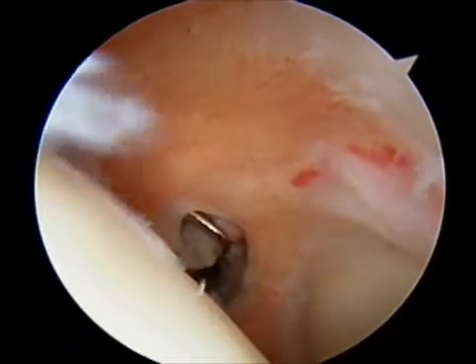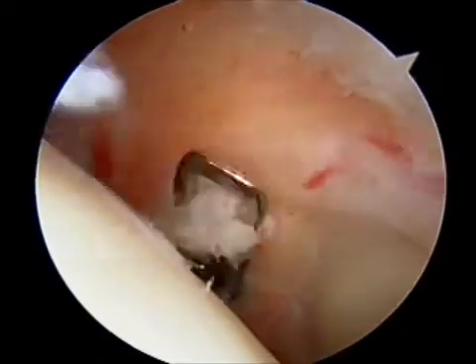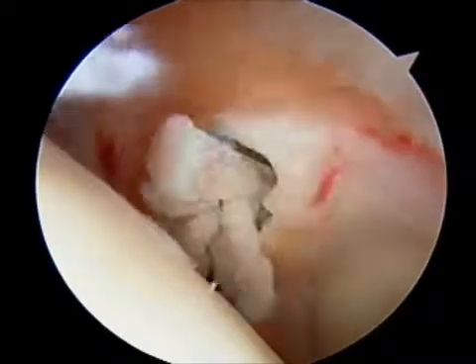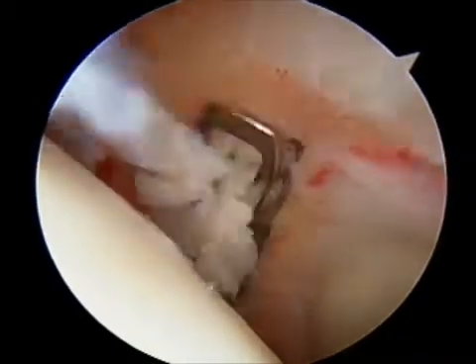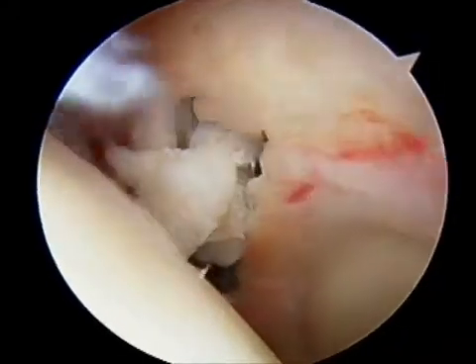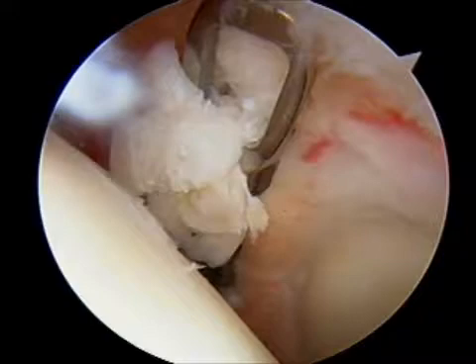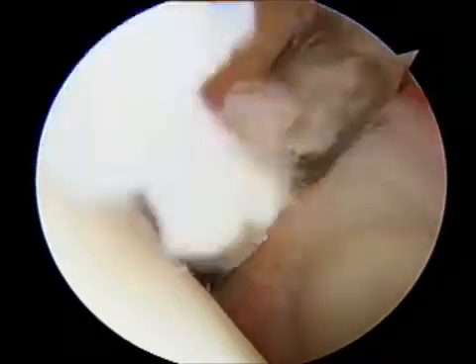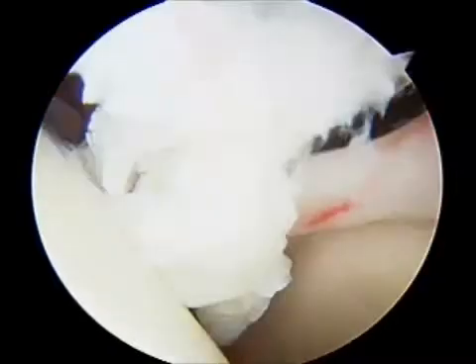This is an arthroscopic example of a patient with adhesive capsulitis who has very tight ligaments connecting the glenoid or socket with the humeral head or ball. In this example, scissors are being brought in and we can, with precision, cut the ligaments without cutting tendons or nerves or blood vessels.